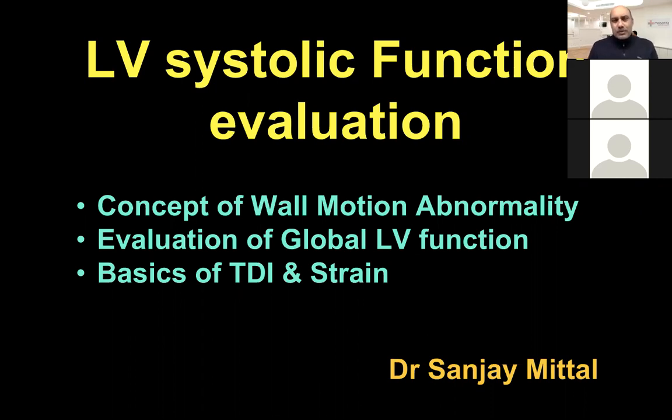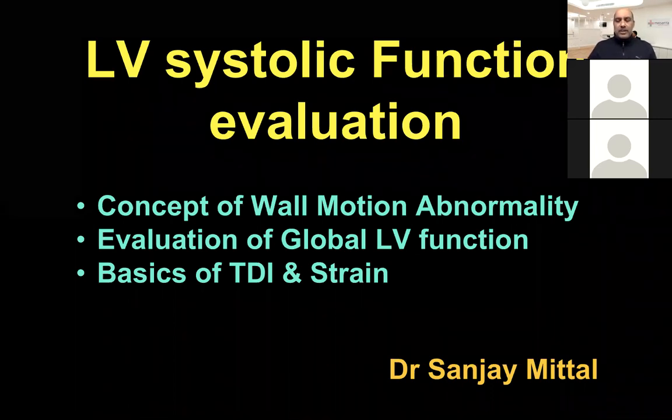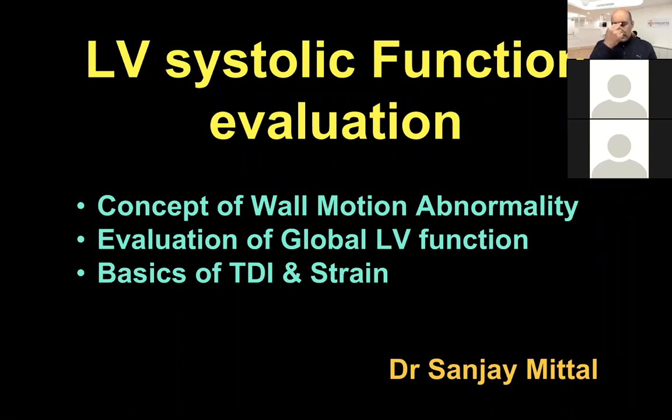What I'm going to talk about today is left ventricular systolic function evaluation, and I'm going to focus, as the topic says, on the concept of wall motion abnormalities, evaluation of global systolic function, and a word about TDI and strain. And as Dr. Rakesh was mentioning, I have been looking after the heart failure unit, and for me, echocardiography is just like a stethoscope. I do it almost on all people to look at their systolic function recovery or otherwise, or to look at the diastolic function, which determines the load situation on the myocardium and left ventricular system.